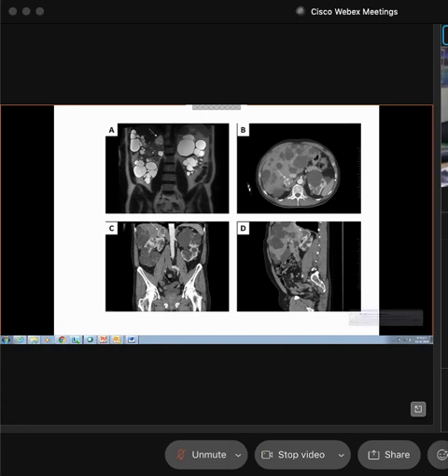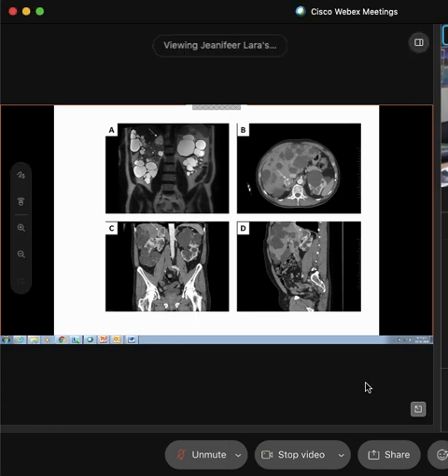But here it's like slicing a piece of cake. You're only going to see a certain slice. If you were to slice a piece of cake, you only have that slice, right? You would see from one side to the other, and this is how we're taking those images.